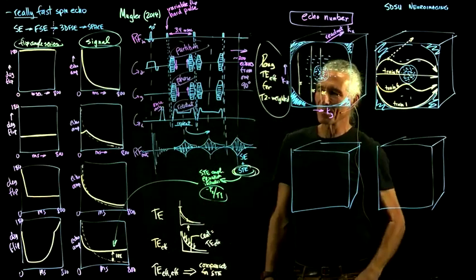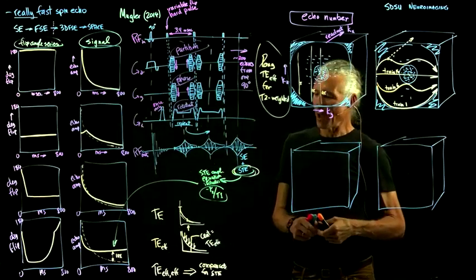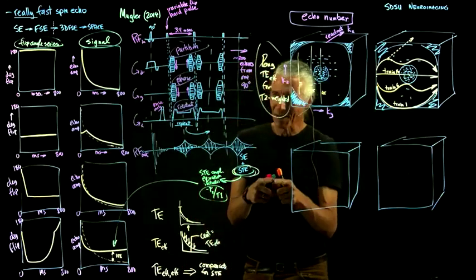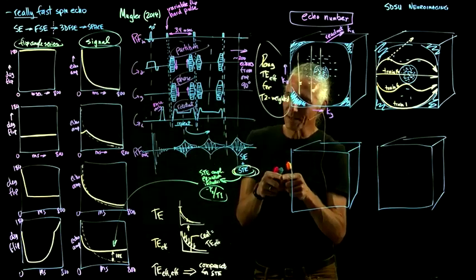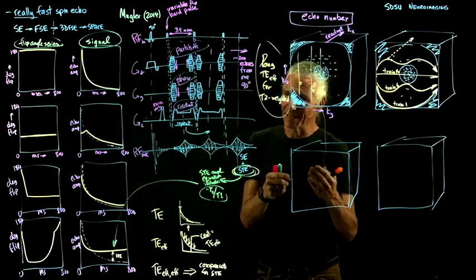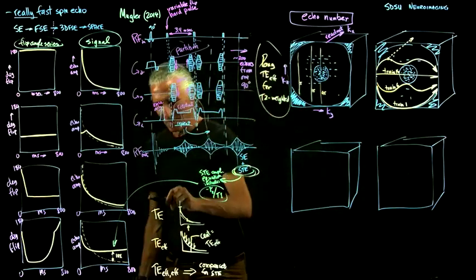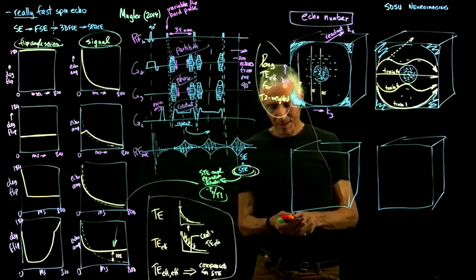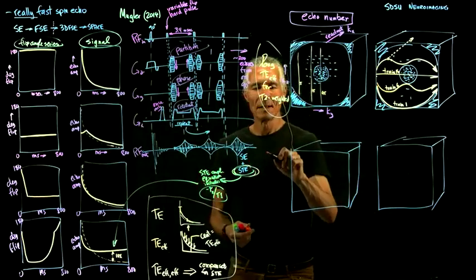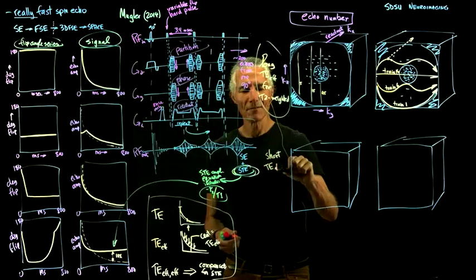So not only is it the time of how long you took to go through the center of k-space, but that number is going to be like 300 milliseconds. That doesn't compute. It doesn't seem like any reasonable echo time, it's way too long. And so then they modify it again. And so then you look on the interface to set a number that is similar to what you would do if you were doing a fast spin echo sequence, but in reality, it's 10 times as long. Yeah, so you can begin to see what the problem is after you really start optimizing these things. And we've got a similar one. So that was a long TE effective, and this one is a short TE effective, for proton density weighted.